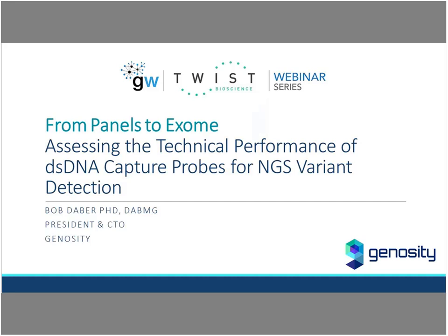And so, as the title says, From Panels to Exomes, the main question we want to address today is whether or not the technology has hit a point where we can begin to think about performing exome sequencing and doing computational slices over designing and updating and constantly feeding and watering the concept of having smaller, more focused panels.